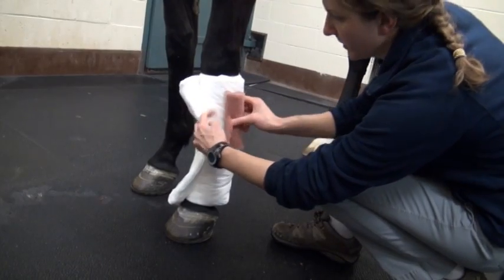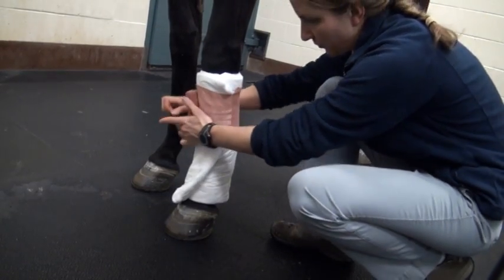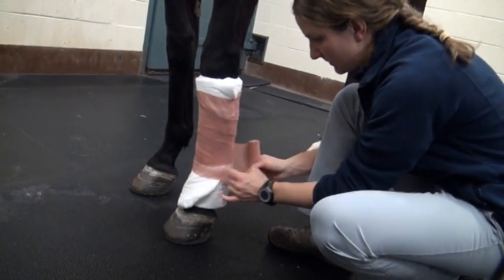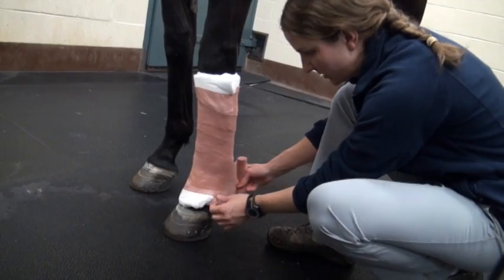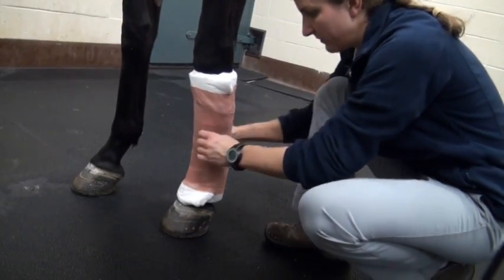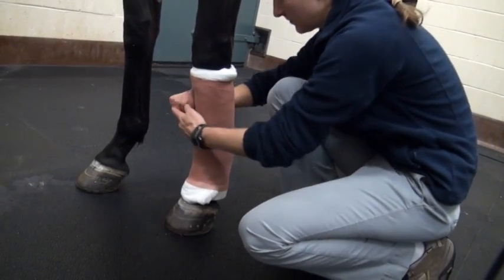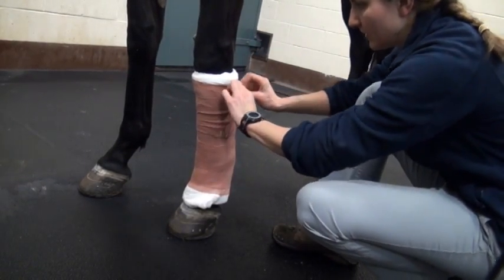The sheet cotton is held in place with the brown gauze. The brown gauze should be placed with firm pressure and with about 50% overlap between each layer. Make sure to leave a small portion of the sheet cotton at the top and the bottom of the limb. Again, once you've reached the bottom, you want to have that little piece of sheet cotton sticking out with no brown gauze contacting the skin. Once you've reached the bottom, just work your way back up, again with 50% overlap with each layer. And as always, make sure you're wrapping in the same direction with each layer of your wrap. Again, with this, you can tuck the tail in to hold it in place while you get ready to apply your next layer.